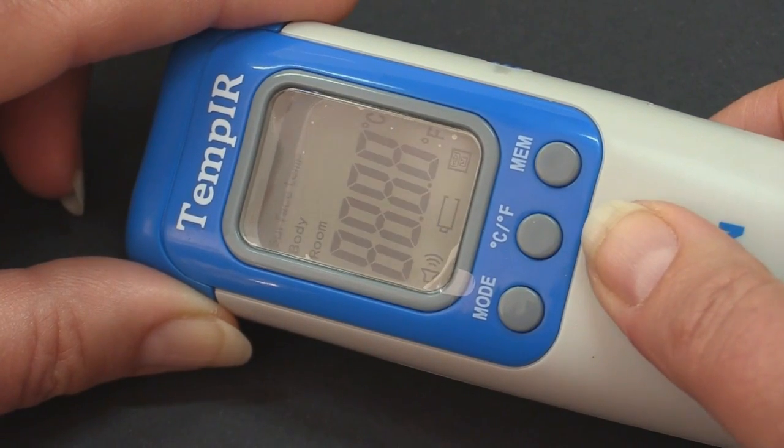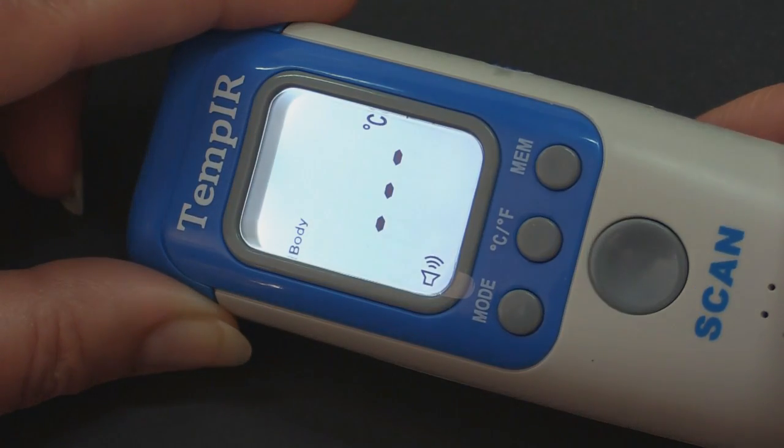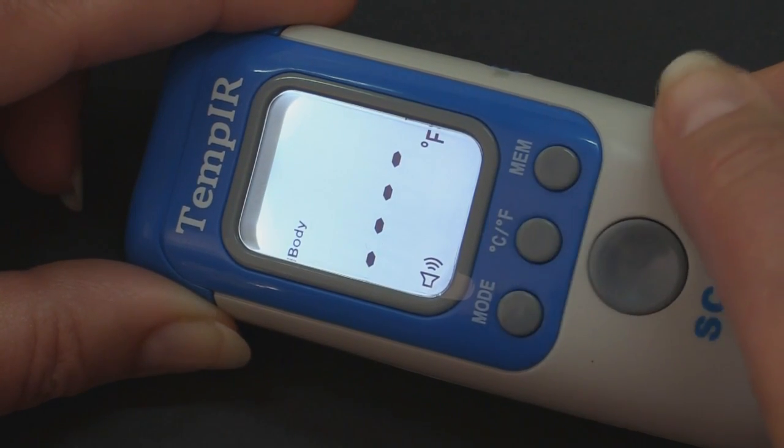Turn the unit on by pressing the scan button once. Press the centre button to select centigrade or Fahrenheit as your preference.